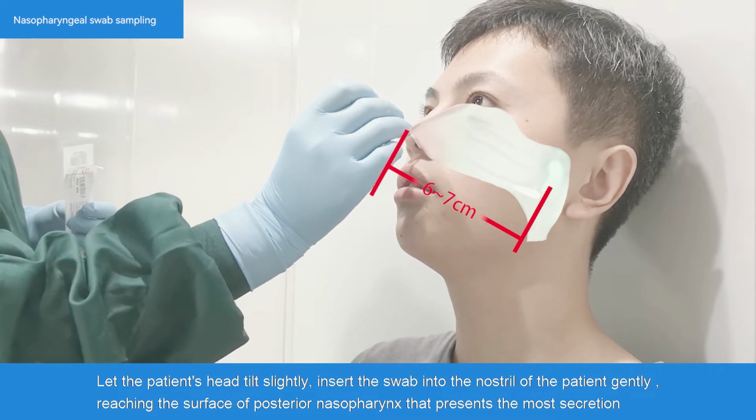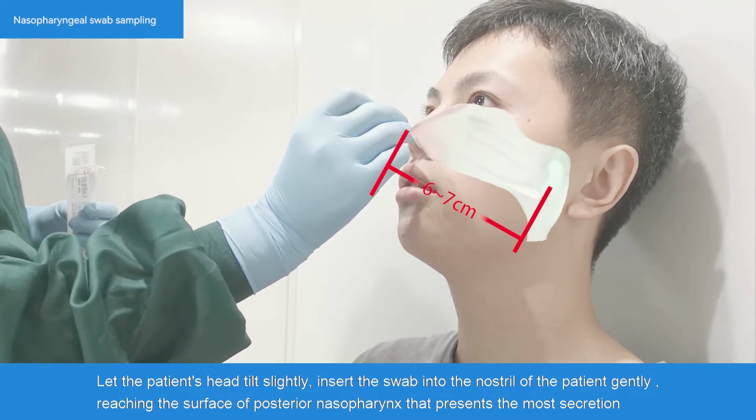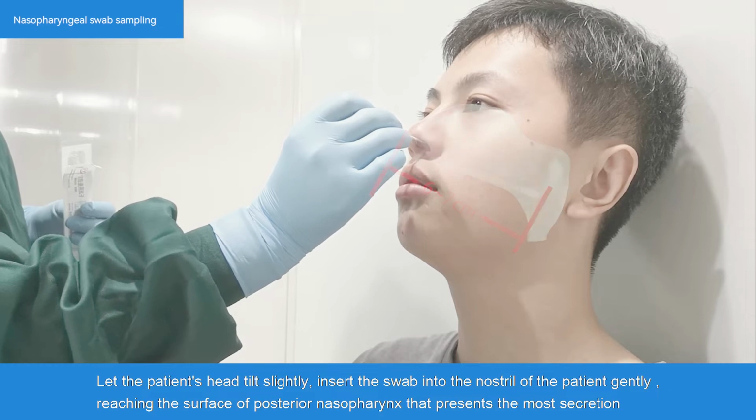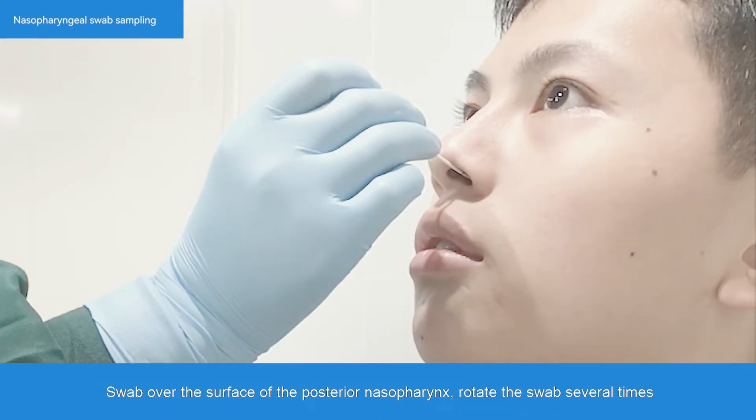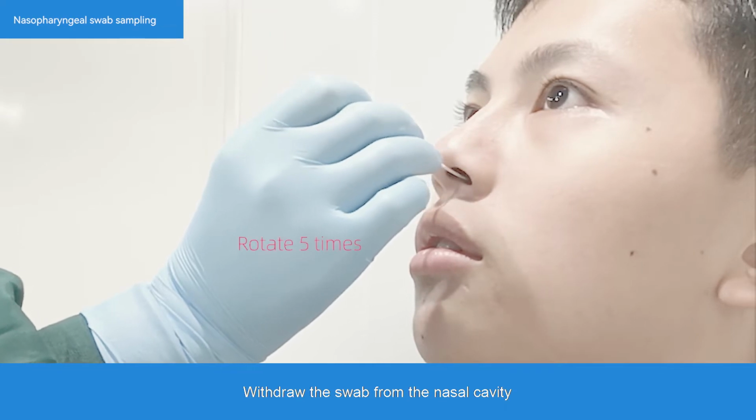Insert the swab into the nostril of the patient gently, reaching the surface of posterior nasopharynx that presents the most secretion. Swab over the surface of the posterior nasopharynx. Rotate the swab several times. Withdraw the swab from the nasal cavity.